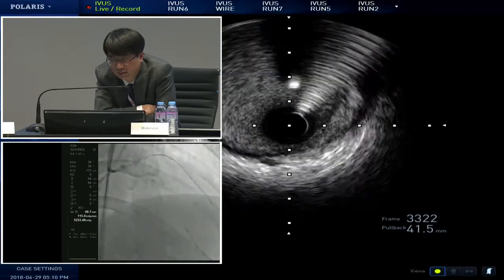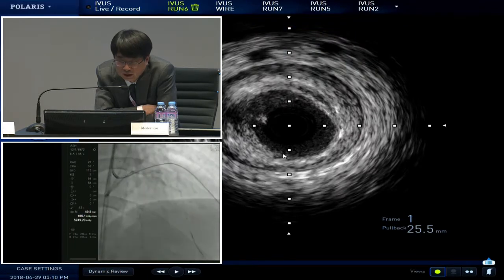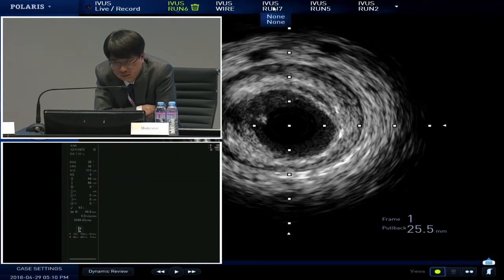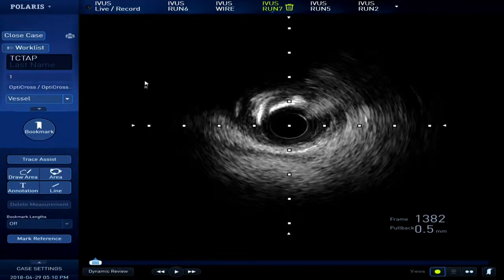Okay, how to put a stent? This part is so diseased. However, you can see there is a zone of low plaque burden. So maybe you can cover normal to normal. It didn't go further, more distal.